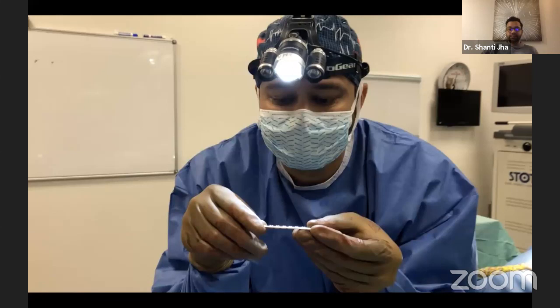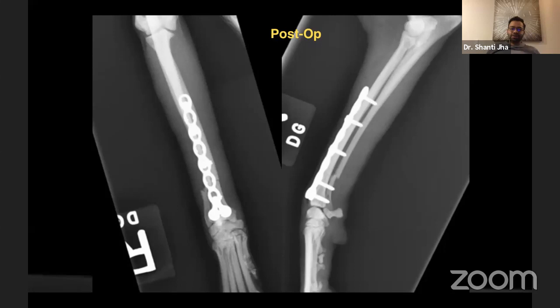So here's the fracture repair, pretty boring surgery, nothing special. We did 3 screws down, and then above the fracture line, we did 3 more screws. It's a 7-8 hole 2.0 plate, a special plate from Synthes, and the fracture is being fixed.